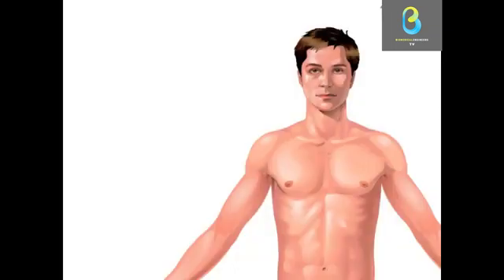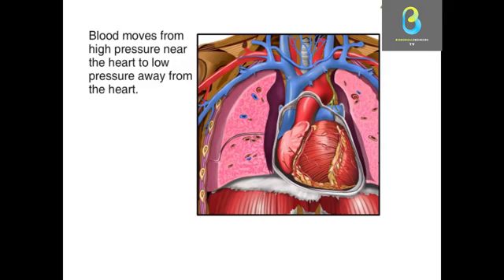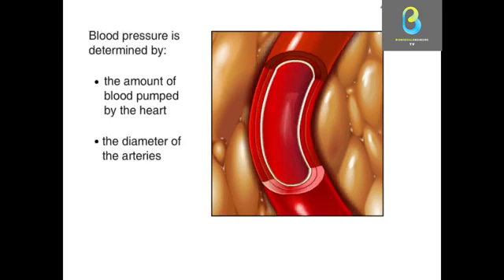Most patient monitoring systems are based on the oscillometric measuring principle. A number of automated blood pressure measuring instruments have been designed which make use of the Riva-Rocci method. This technique was introduced by Riva-Rocci for the determination of systolic and diastolic pressures. Initially, the pressure in the cuff is raised to a level well above the systolic pressure, so that the blood flow is completely terminated.